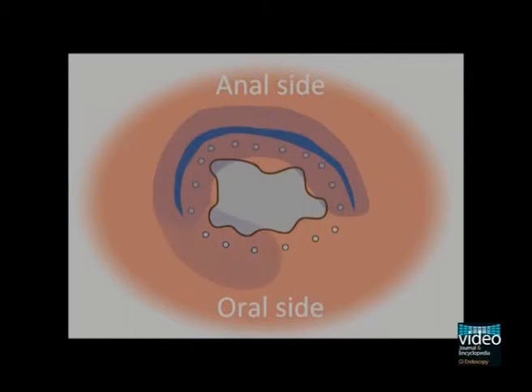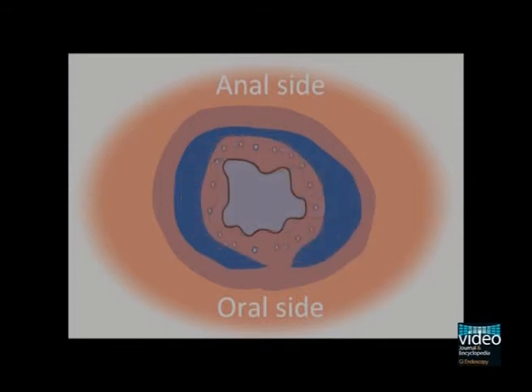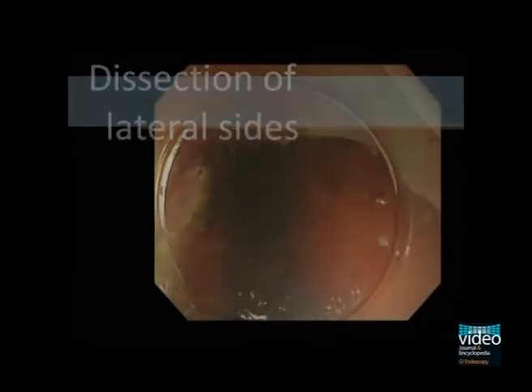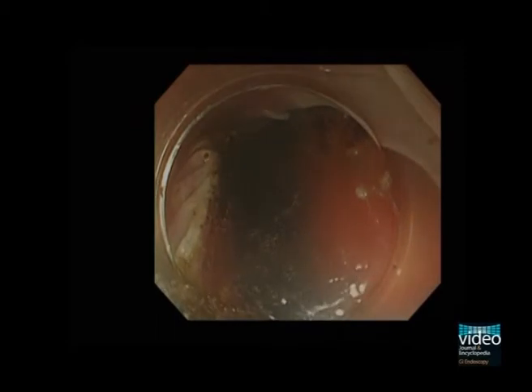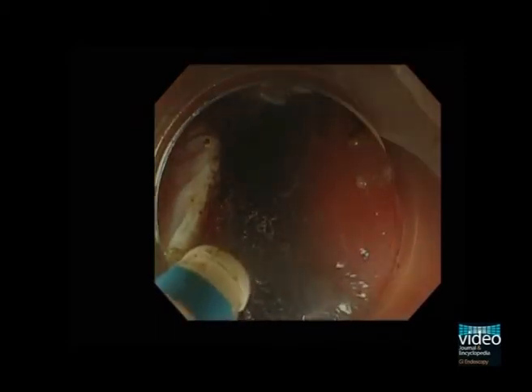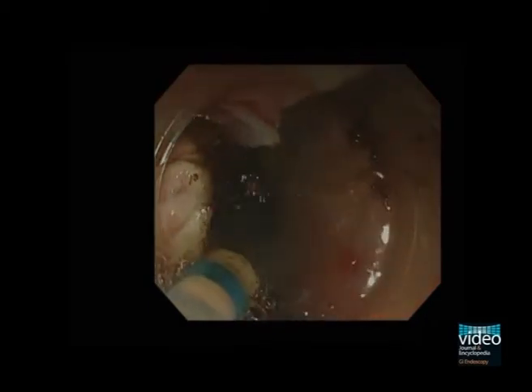And then we make incisions in its oral side. At this point, we still keep a small uncut mucosa in the most oral side, which is a small mucosal connection between the lesion and oral mucosa. Tension due to this small connection makes it easy to dissect lateral sides of the lesion. At this step, we expand the submucosa by transparent attachment at the tip of the endoscope, and make dissection of lateral sides of the lesion as far as possible.